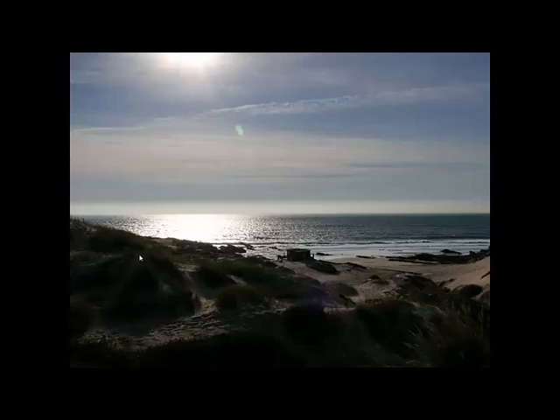I would like to show this picture now. This is a raw image taken with my camera without any image processing. We see, for example, that we don't really know if this area is completely white because I'm applying the wrong window level or because the detector was in saturation. We don't know. And also here in the black area we are lacking information. The image is too black and we don't see much here.